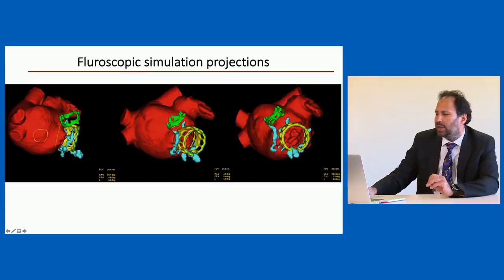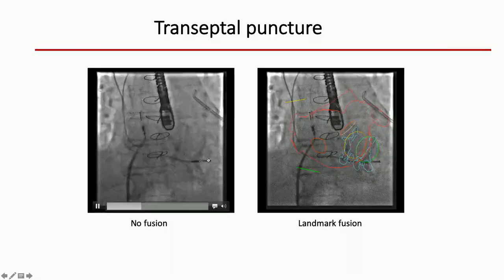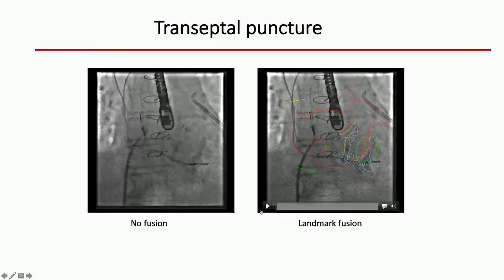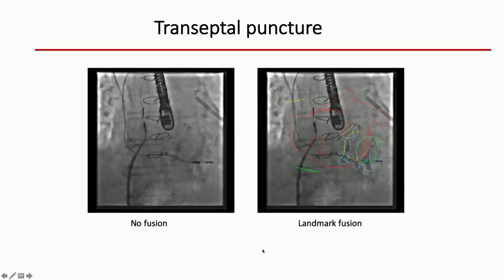So how does this look in the real world? Here you can see on the left-hand image what our interventional cardiology colleagues would have if there was no fusion available. And on the right-hand image, you can see what happens when we make available, using the Valve Assist platform, landmark fusion.